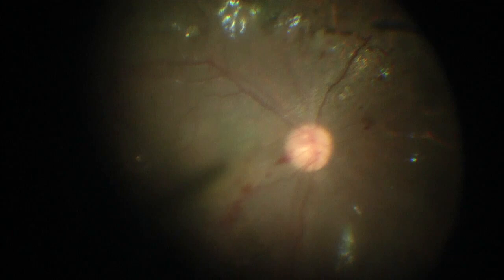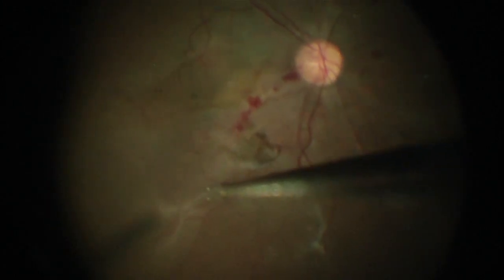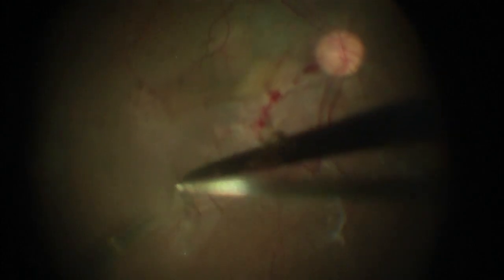Now we have the full setup with two additional trocars and go to the back of the eye. In this case there are membranes I needed to remove. This is a patient who had recurrent retinal detachment — a child — who was left under silicone oil, resulting in more membranes forming with retro-oil proliferation.